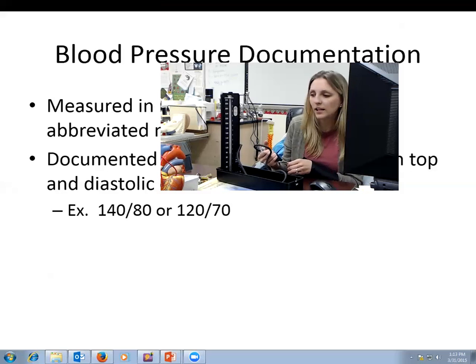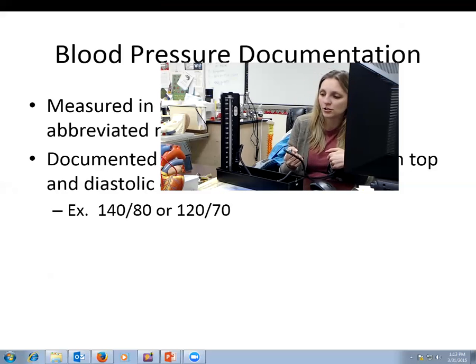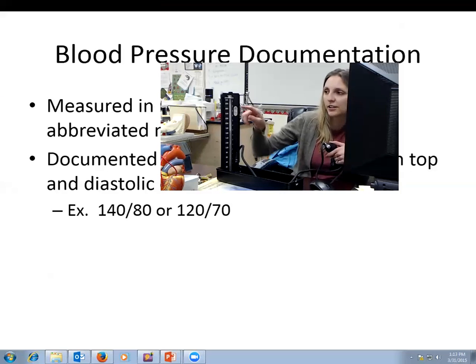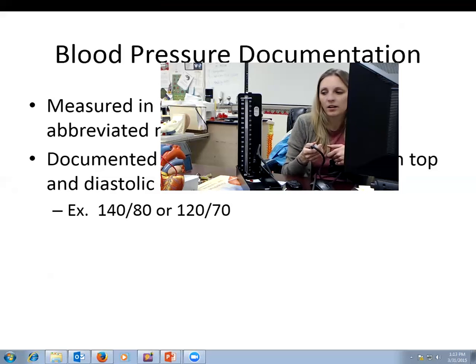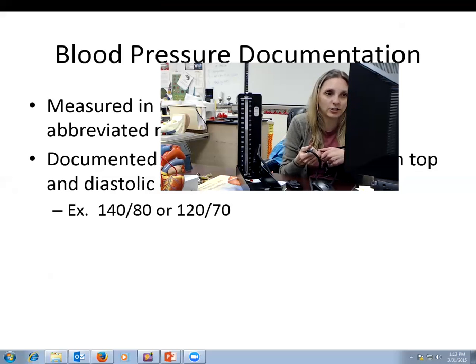Okay, everybody see how, not really made to go right here, but I just want to show you guys the mercury in here. See, everybody see how that's moving? This right here is moving, and there's numbers all along the side right here, okay? And so what it's doing is, now you can see a little bit better. This is mercury, and these are measured in millimeters.